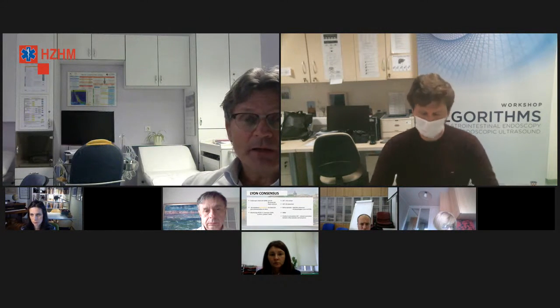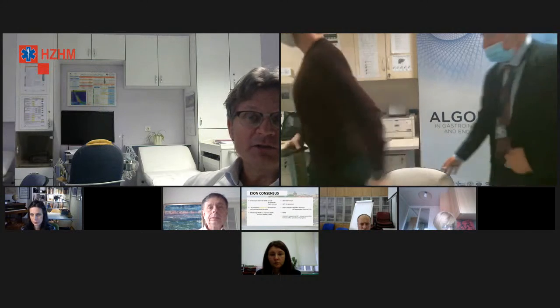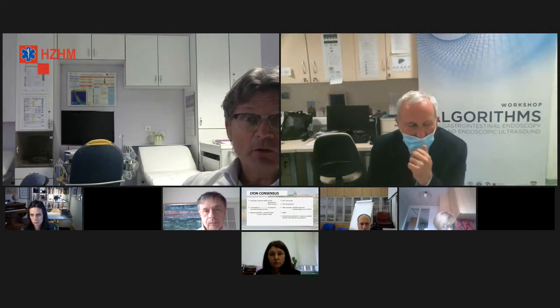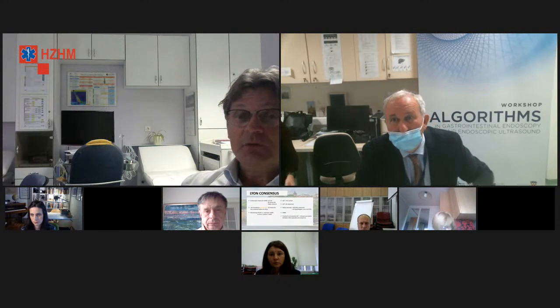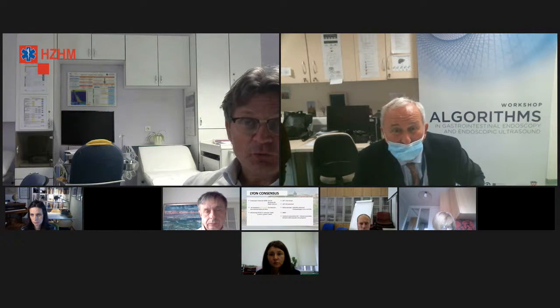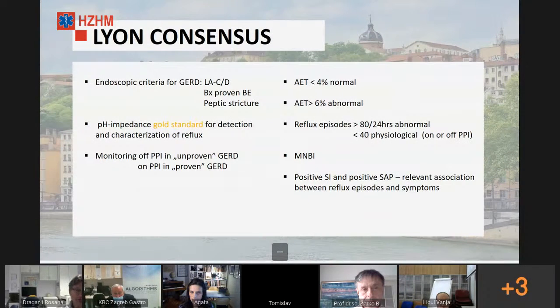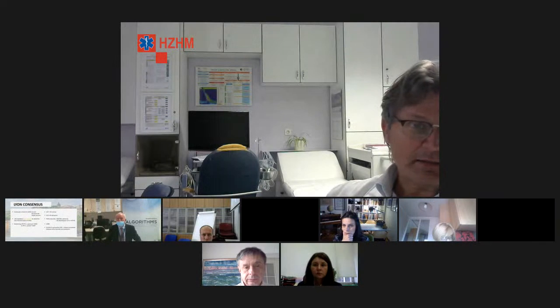Zato tu treba na neki način odmjeriti cost benefit i vidjeti što zapravo. Mi se uvijek moramo pitati što mi zaista pacijentu dobijemo, onaj added value, kako bi rekli, što dobijemo sa dotičnom pretragom.